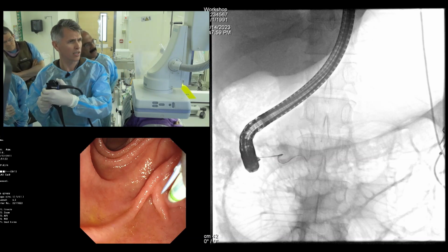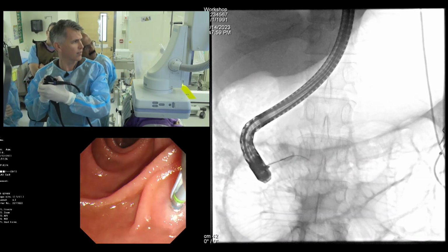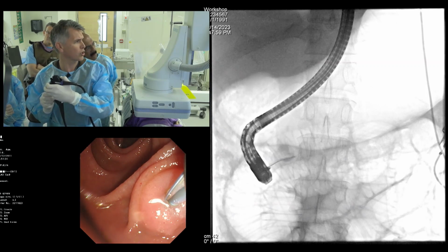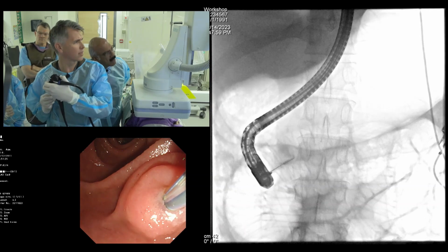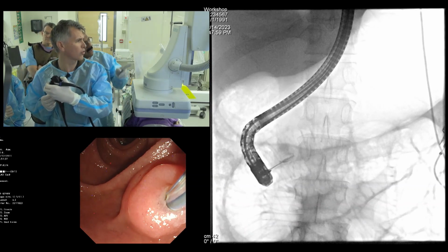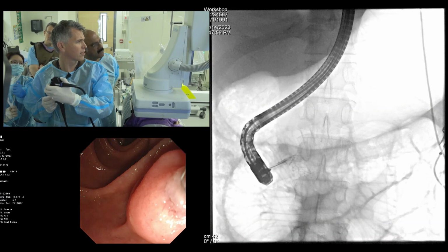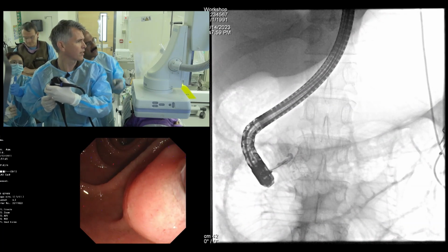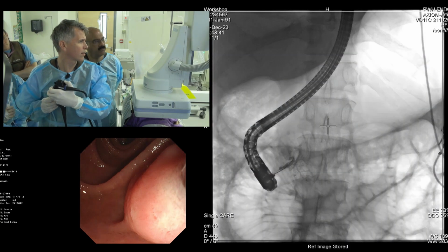Nice. So please leave the guide wire there. Maybe that's a side branch there. But now push. Now we go down, then pull back, pull back, and now we give a little bit more contrast here. That's the stone there. We have the side branch here, and then it's turning around and going to the stone there. Yeah, very nice. Beautiful demonstration.